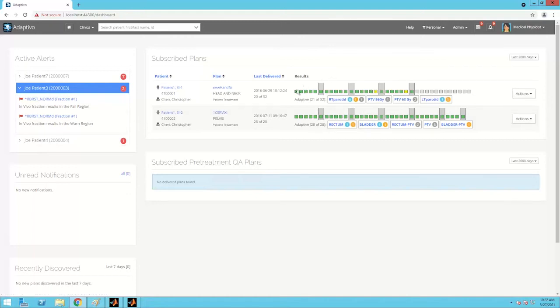And then in this area, you can see some patients where we have the chiclets because we have both the in vivo as well as the adaptive dashboards combined. And so here you can select any of the chiclets to go in deeper for plan review, or you can select the ROI-based alerts and review the cumulative rule breakages for this particular plan or the daily differences. So by hovering over, you can see those differences as well.